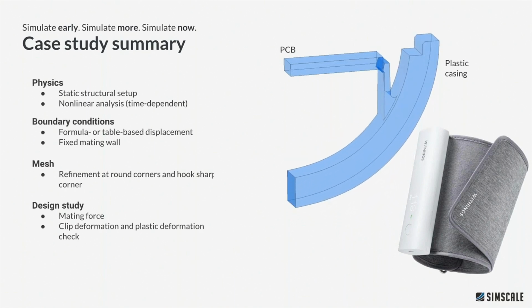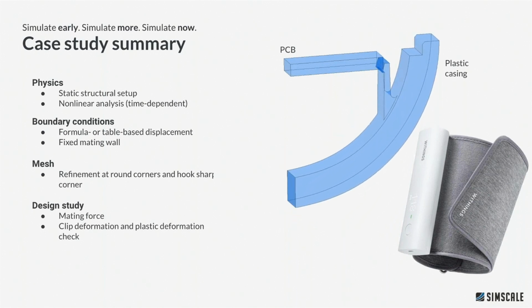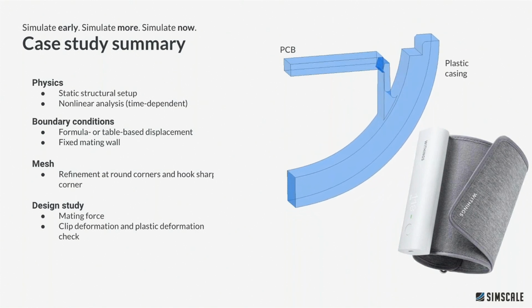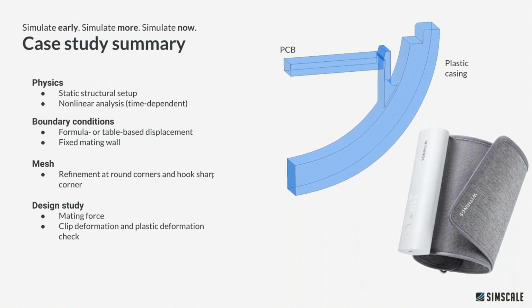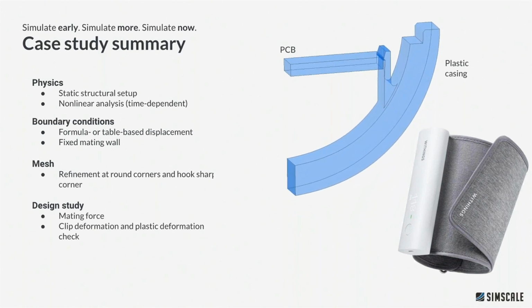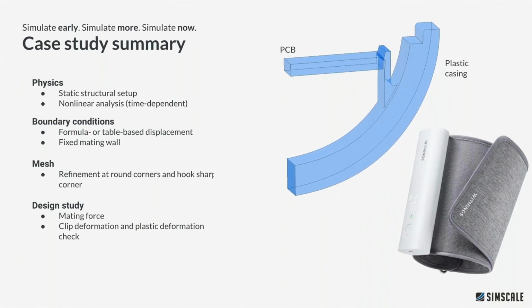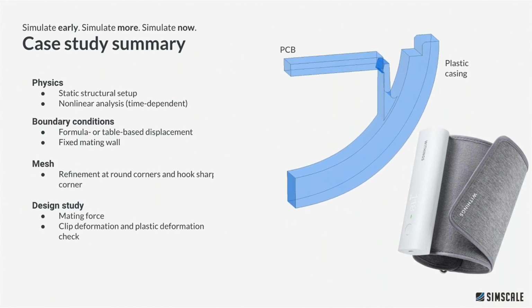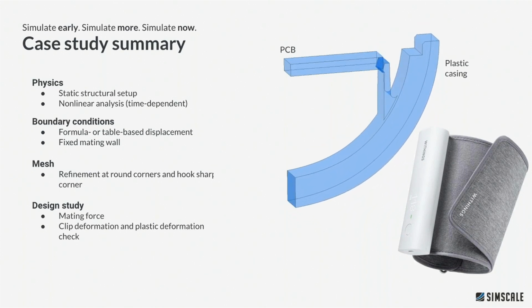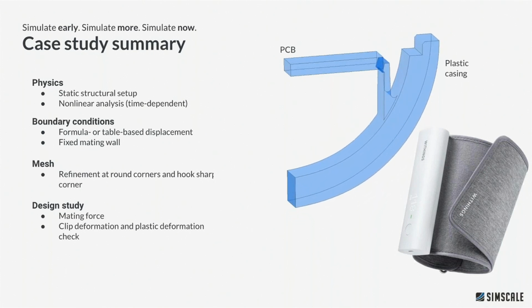And this is reality. So we also had this case in real life. So a plastic part must be assembled to a PCB, an electronic board. And this is a white casing. This is the shell that we have here. And this is a static structural simulation, but it has a nonlinear setup, as the stress distribution is going to vary with time as the two parts are gradually assembled together. So as the plastic casing moves up, the PCB is going to have different stress distribution with time.